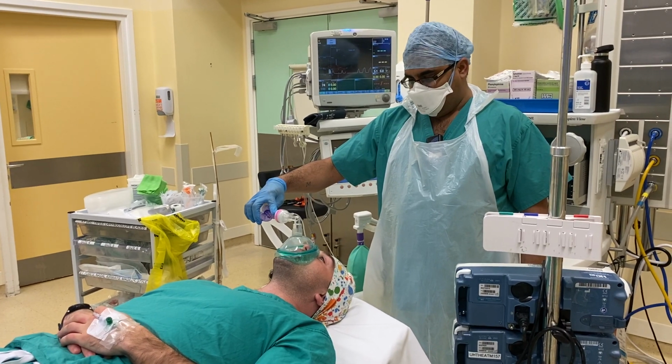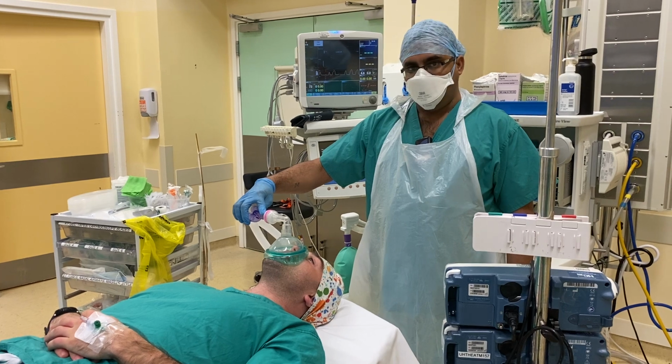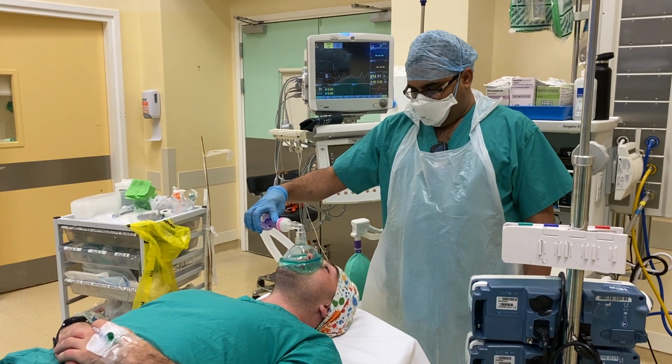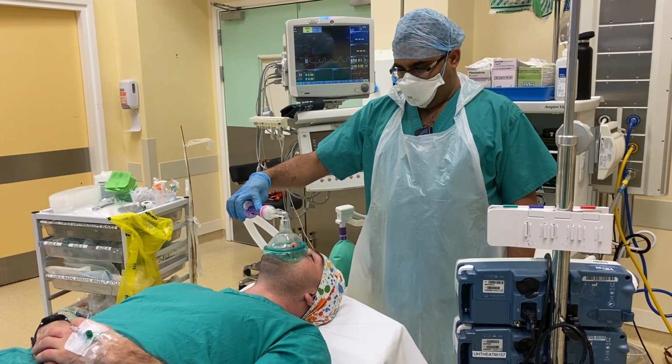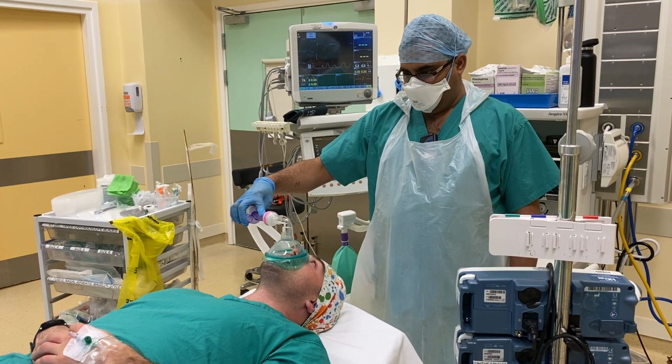Okay guys, in this video I'm going to show you how to hold a face mask. It's very important to learn how to hold a face mask for a number of reasons, but the main ones are whenever you're any kind of doctor in any kind of specialty, if someone does collapse, it is important to be able to get a good seal over someone's face and to be able to deliver air or oxygen to somebody.